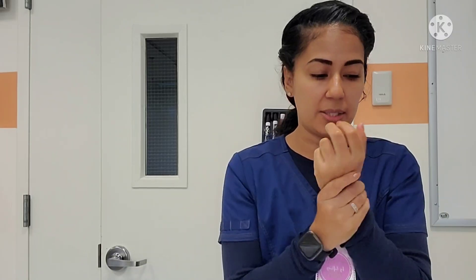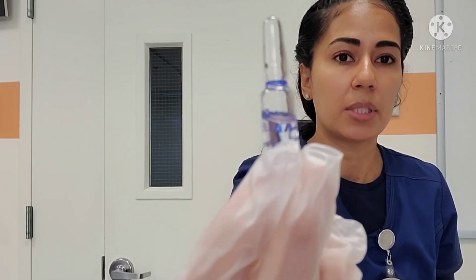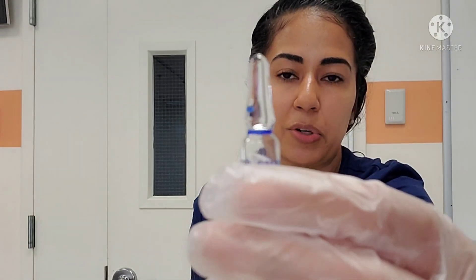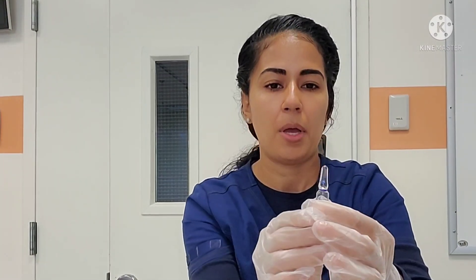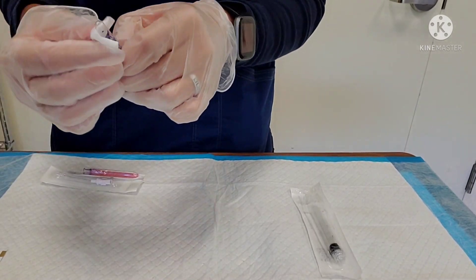The first thing I'm going to do is perform hand hygiene and make sure that my hands are clean. I'm going to put on a set of clean gloves. This is not a sterile procedure — it's a medical aseptic procedure — so we're going to grab an alcohol swab and clean the ampule. I've already checked the ampule and it looks good, it's not expired and everything is okay. Whenever you're using an ampule — this is what the ampule looks like — this is the neck of the ampule, where we're essentially going to be breaking the top. This one has medication on the cap, so all I'm going to do is go ahead and flick that, and you can see it just goes right to the bottom. So I've cleaned the neck of my ampule.